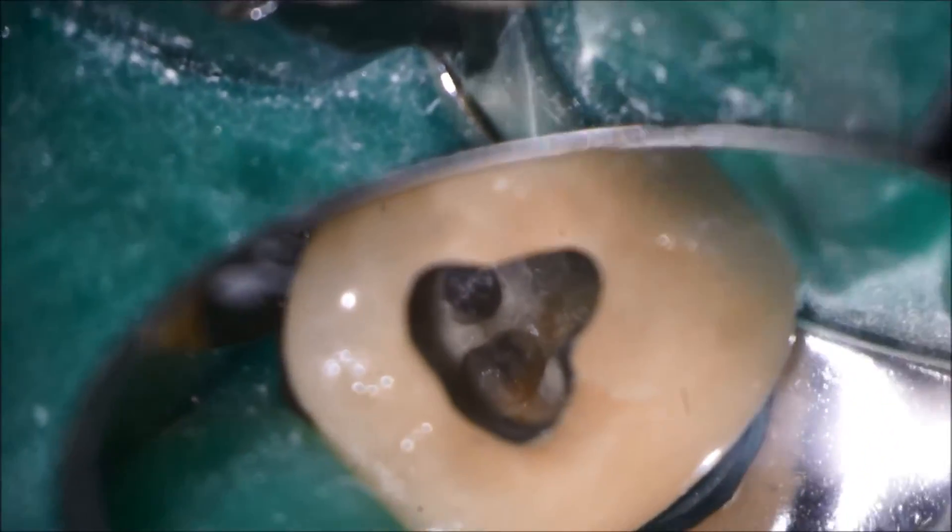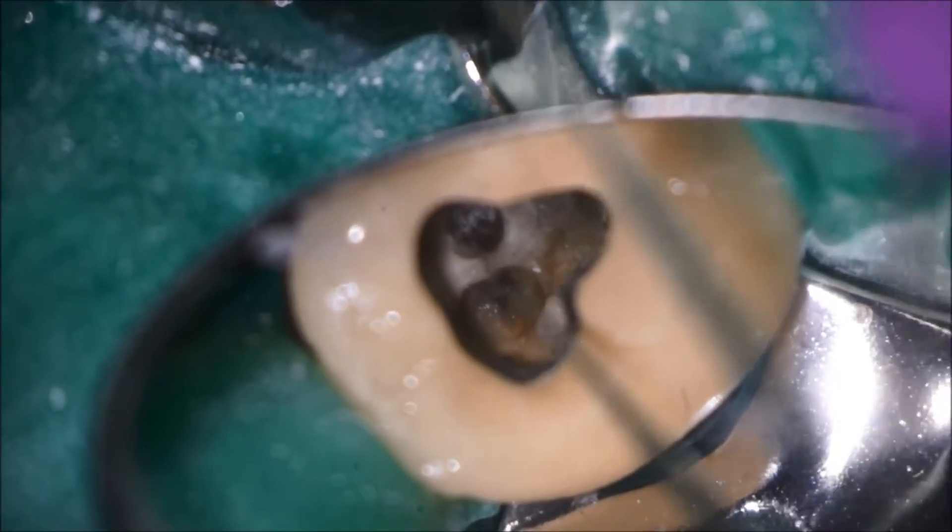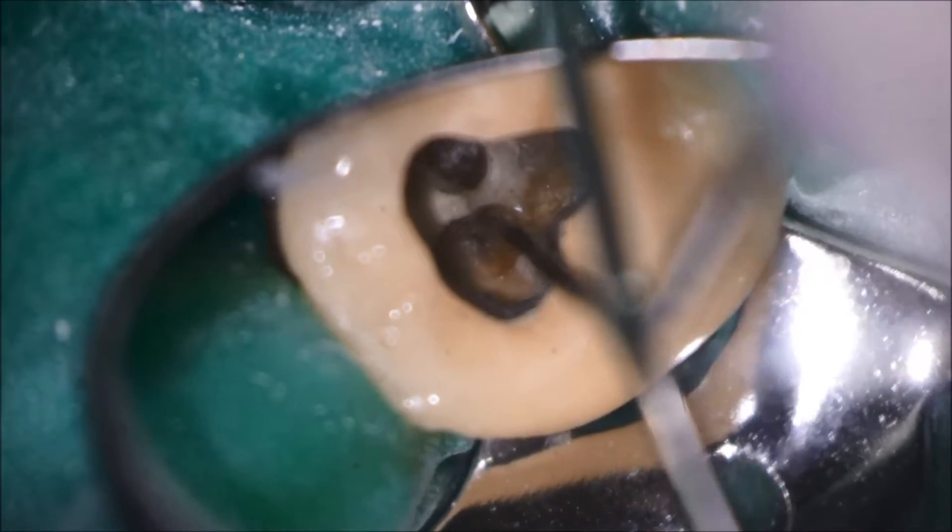Once a canal has been located with an explorer, a micro-opener is very helpful in beginning to open up the canal.